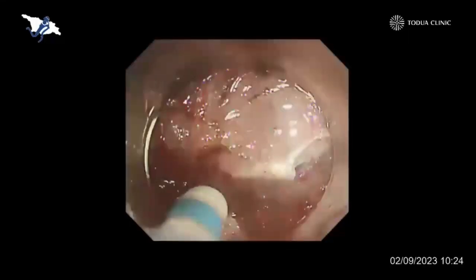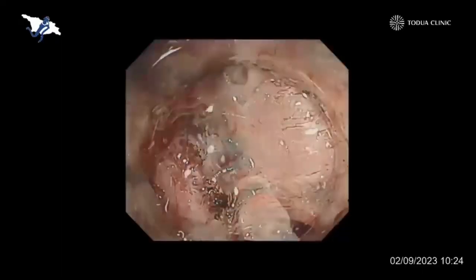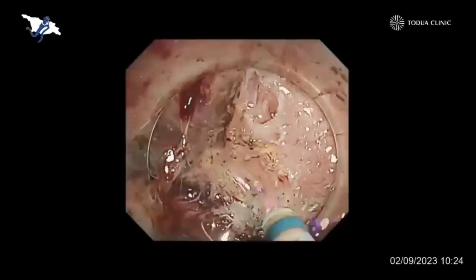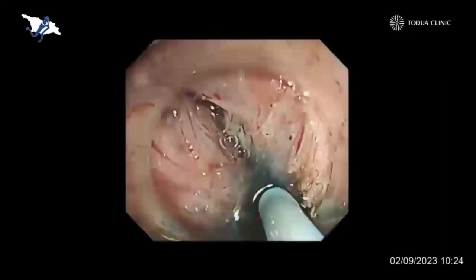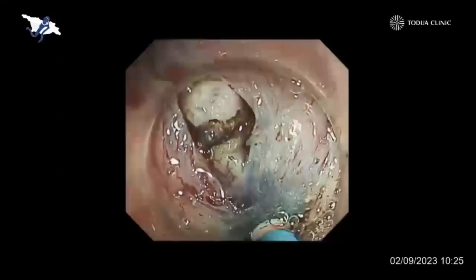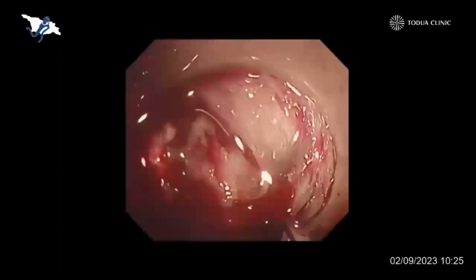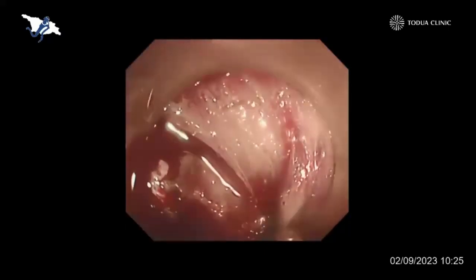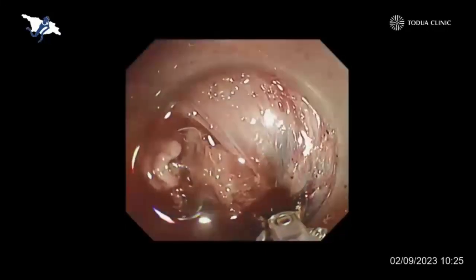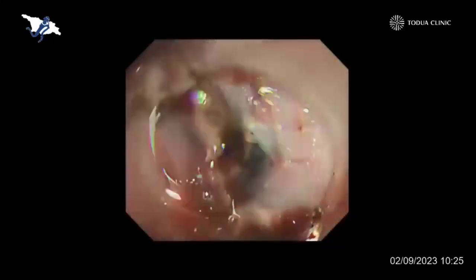We couldn't recognize the right dissection plane because it was completely fused with the muscle layer — there was no submucosal tissue remaining. That's why I decided to cut through the muscle layer itself. By injecting additional solution on both lateral sides, I could recognize the true dissection plane, then connected to the dissection plane by cutting through the muscle layer. Of course, there was a thick blood vessel within the muscle layer, so I encountered severe bleeding and used coagulation forceps to stop the bleeding — it was quite effective, although a little challenging because of poor visibility.